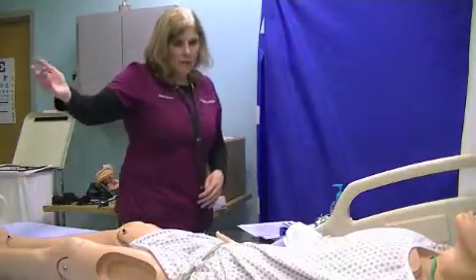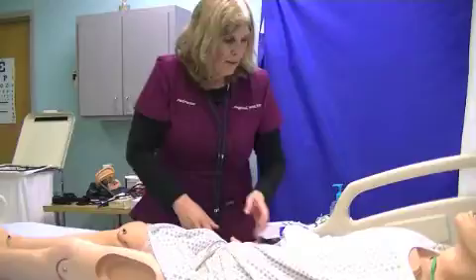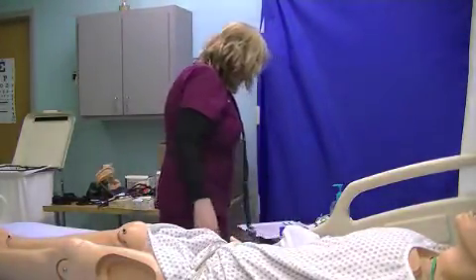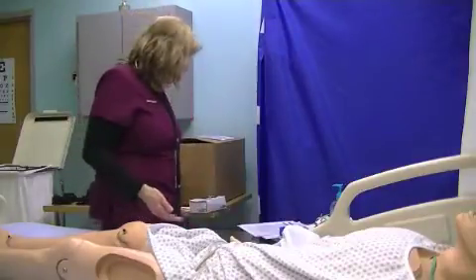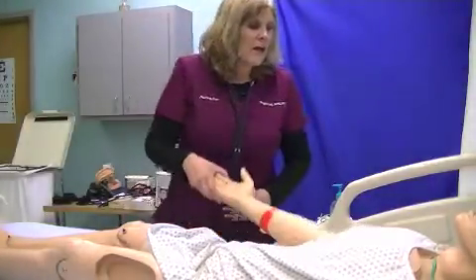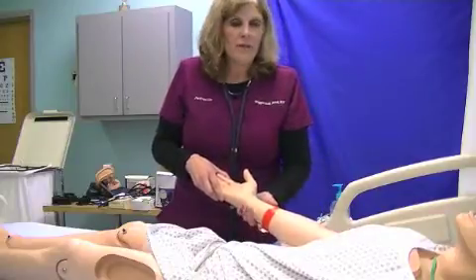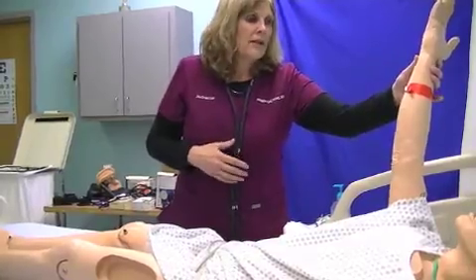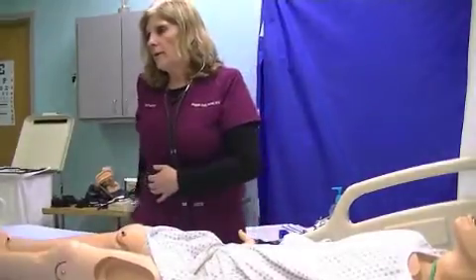They should be laying with their arm out like that, palm up, to make sure you're getting good blood pressure. And if they're sitting in a chair, their feet have to be relaxed and flat on the floor. And like I said, not crossed. When they're laying down, the arm needs to be supported here at the level of the heart. Because if it's above, it's not going to detect there's really an arm there, so it's not going to pump as hard. And if you have the arm down, it's going to pump harder.